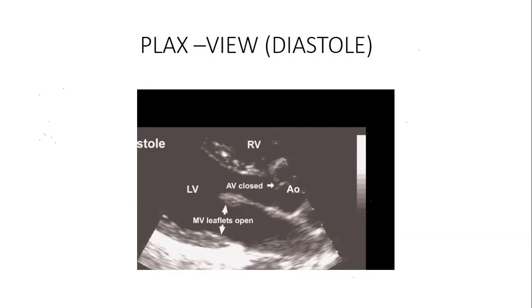It's a question of understanding now that these muscles have relaxed, and what is exactly happening within each and every part of the heart. I asked, I think, was it Twambo or Judith to say the four diastolic phases. They are very, very important: isovolumetric, the rapid filling, which we call the E, the slow filling, and the atrial kick.